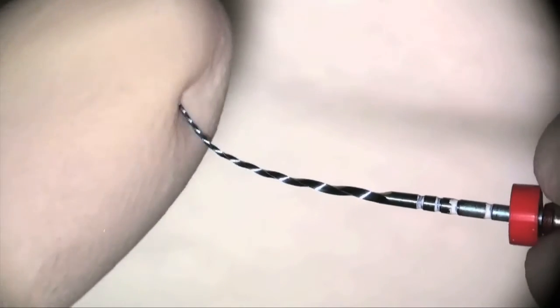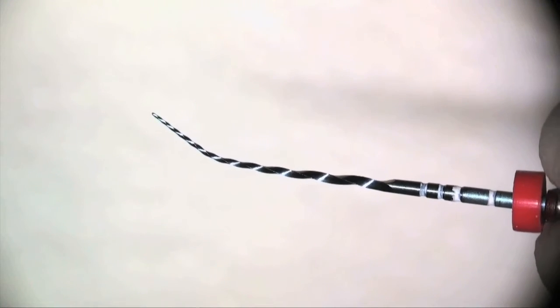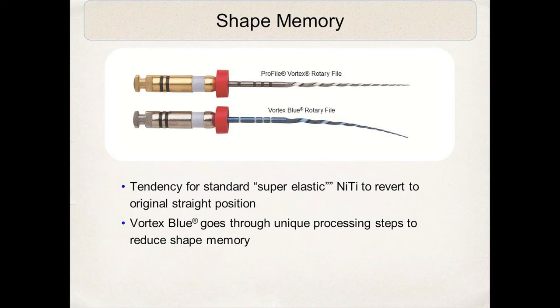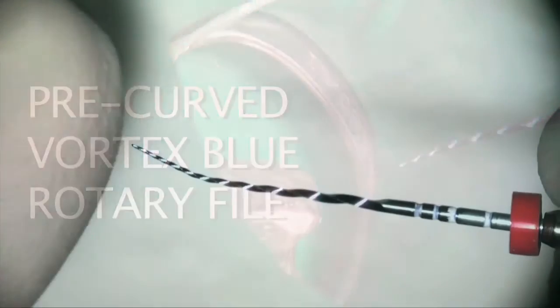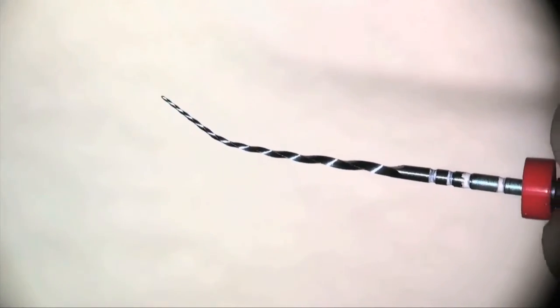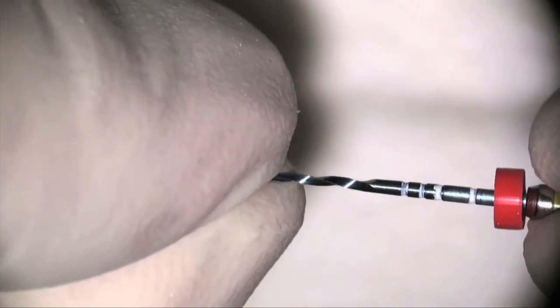This video will show the flexibility of the Vortex Blue file. For demonstration purposes, we're doing this with gloved hands — clinically, we would use sterile forceps. You can see the reduced shape memory: it does not come out of the box straight. There's a little curvature, and as you place the curve, some of it remains. We take advantage of this reduced shape memory by pre-curving these instruments, which is an amazing advantage for maxillary and mandibular posterior molars.